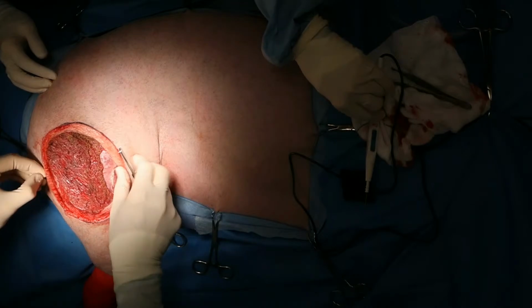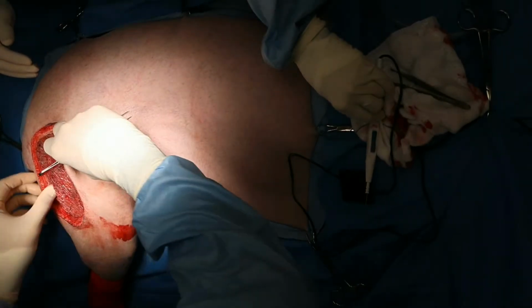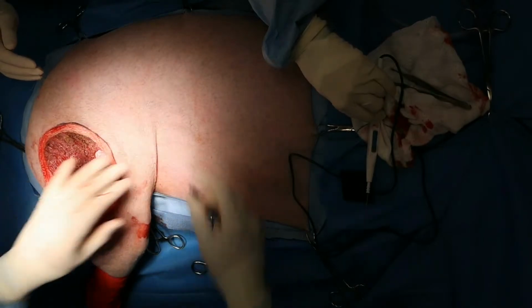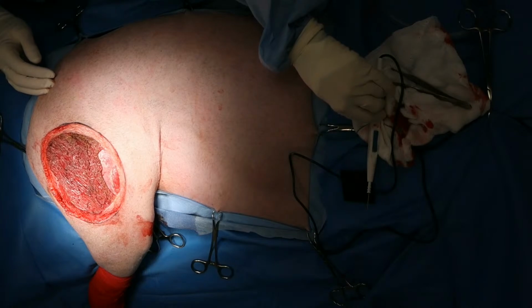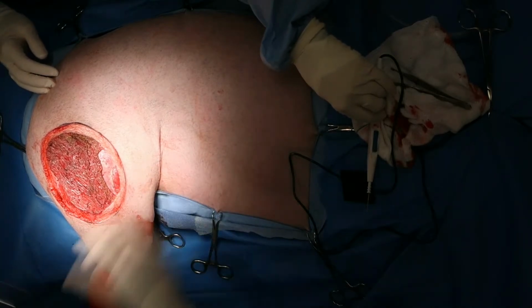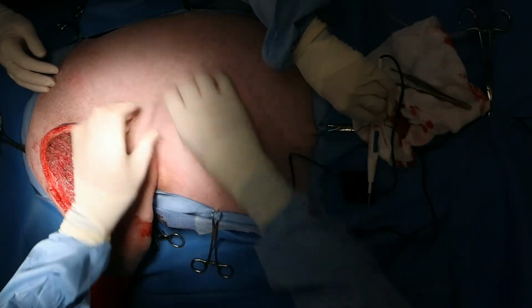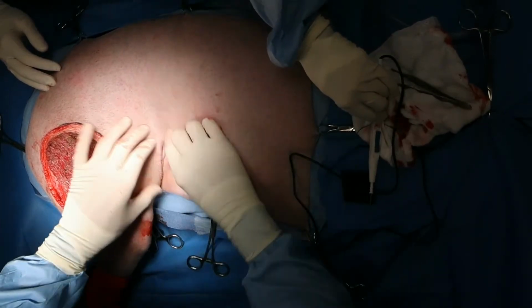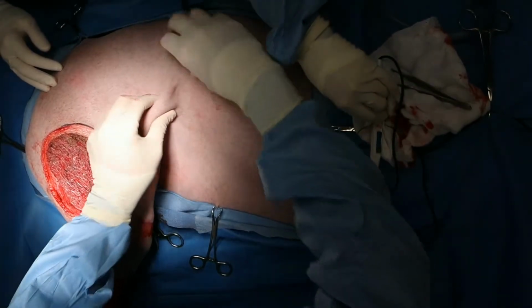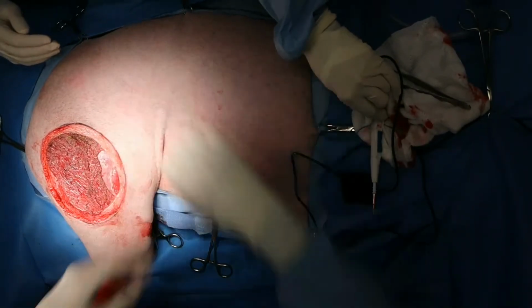And then I can't really do much more. The only question is whether I could close this primarily. It's going to be under a lot of tension, so I will go ahead and do that flank fold flap. I'm very confident with my margins here, so I'm not worried about contaminating my donor site, which is something to consider. Where can we get the most? I think probably something like that. It's going to be the way to go.